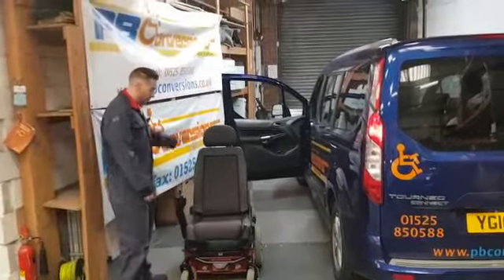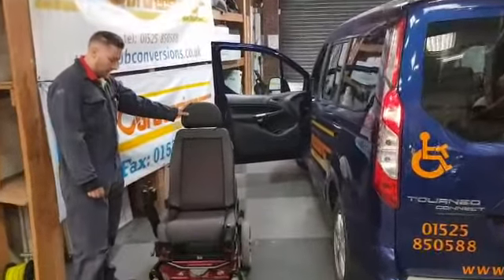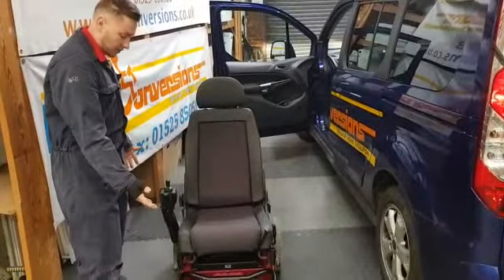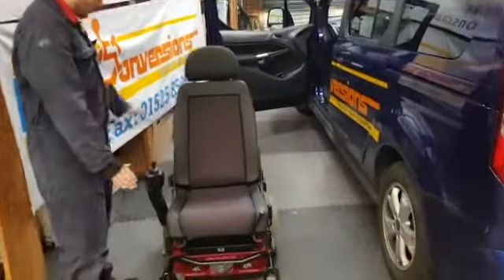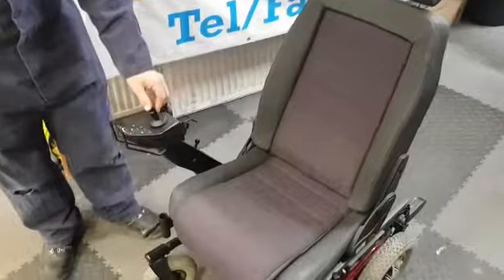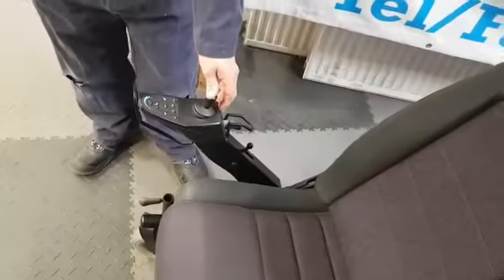This is the Corone Go with the F-Seat on it. First thing we need to do is switch on the handset. This has an electric rise and fall, so if we press the seat it goes up and down.